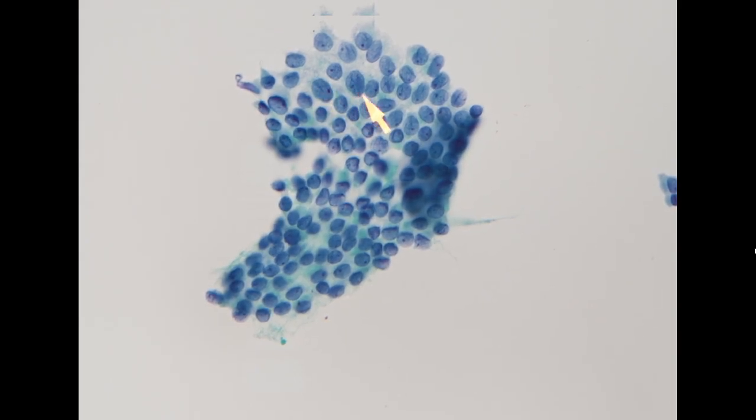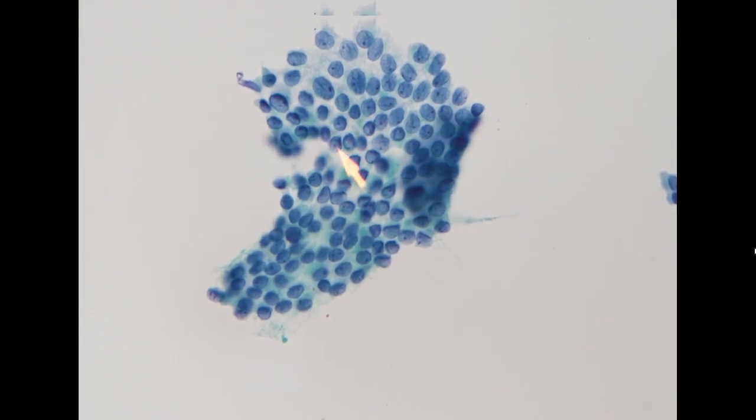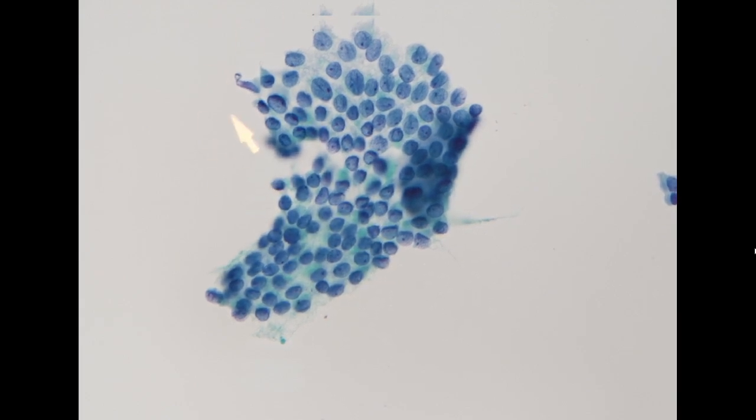So here we can appreciate the cells are enlarged and mostly are in oval shape. And if you draw a long axis of each of these cells, you can appreciate that these axes are all crossing with each other. So we realize this is actually a disorganized arrangement, disorganized pattern.